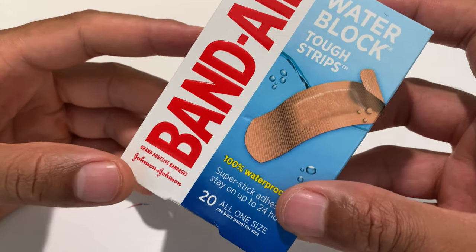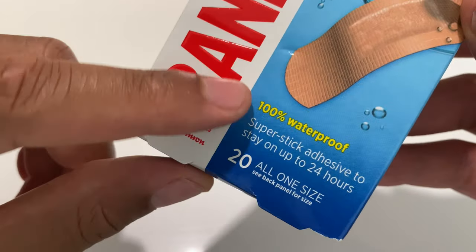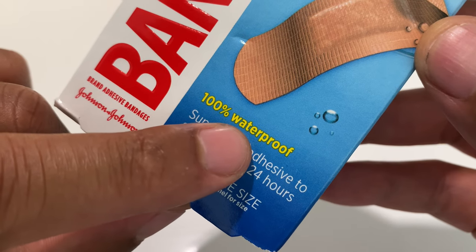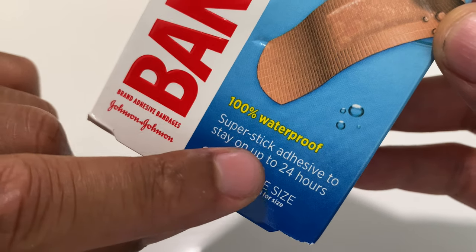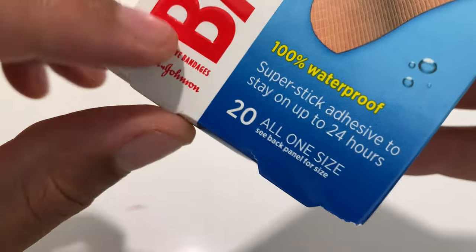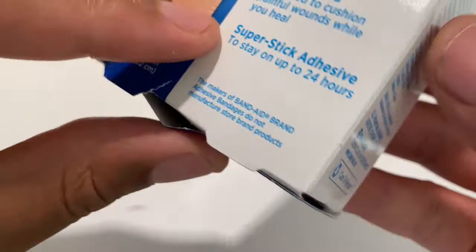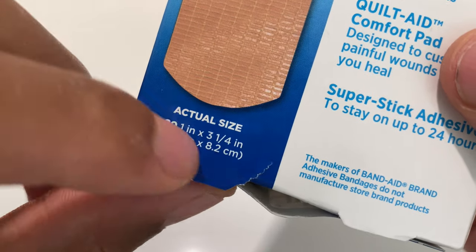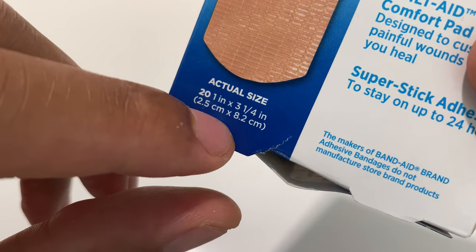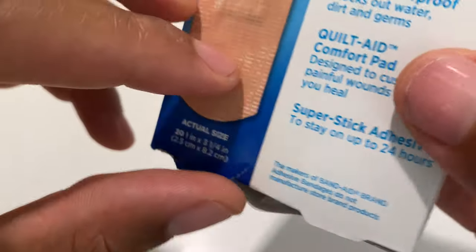Today I have Band-Aid by Johnson and Johnson Water Block Tough Strips. I bought these because they are 100% waterproof, as it says on the front of the package, with super stick adhesive to stay on for up to 24 hours. Inside comes 20 bandages, all one size: one inch by three and one quarter inch, or 2.5 centimeters by 8.2 centimeters.